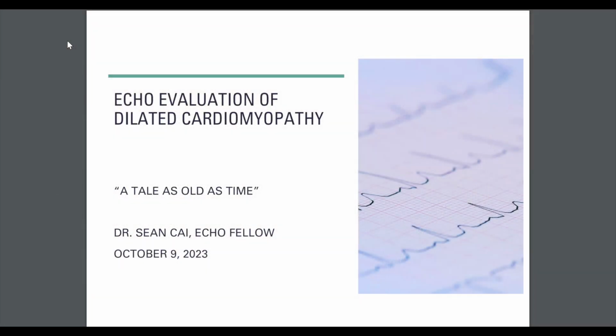Today's talk, I've tailored towards a general audience, with some brief review of some of the guidelines that I hope can be helpful for some of the junior trainees on the call, for them to think about when they see a patient with dilated cardiomyopathy.